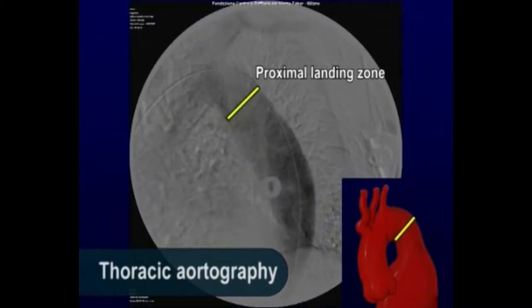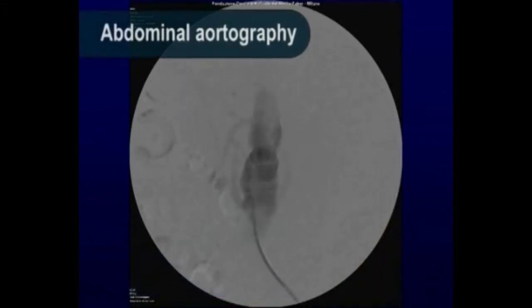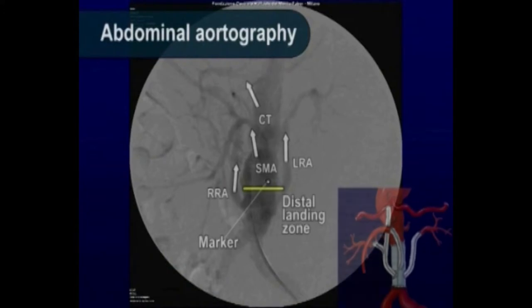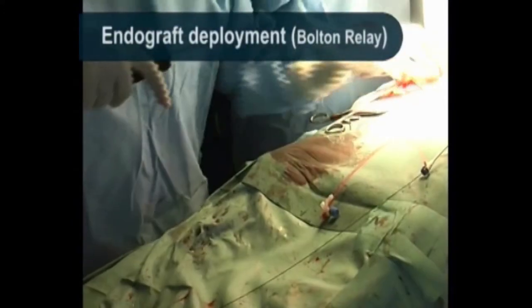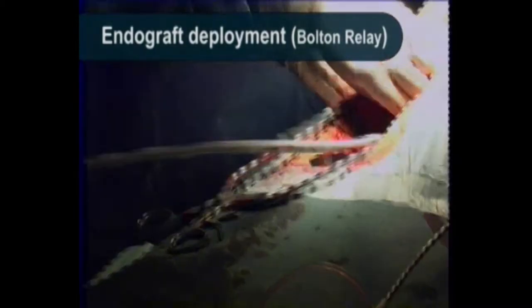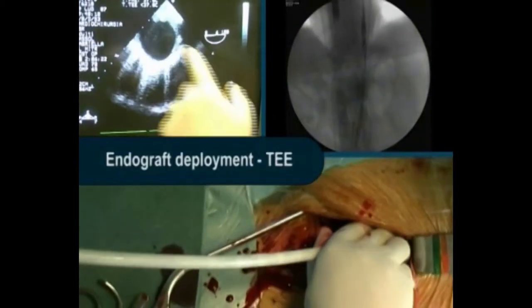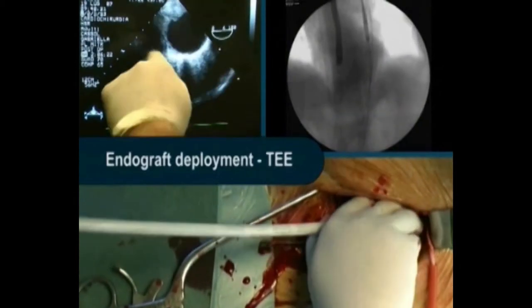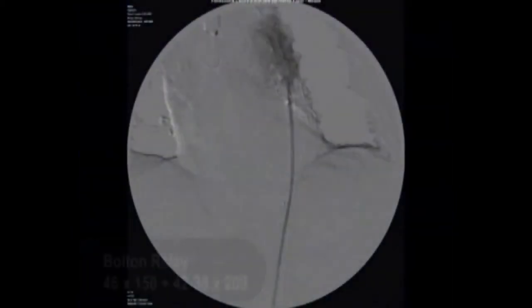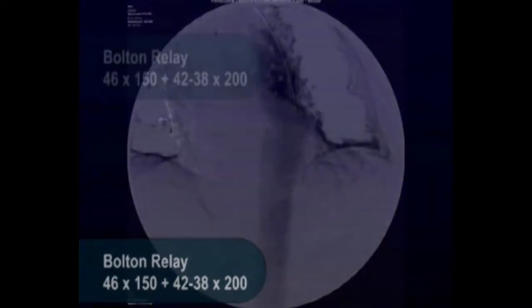An initial arteriography is taken to visualize the proximal and distal necks. Patency of the branches to the visceral vessels is again checked. A regular cylindrical stent graft is inserted through a peripheral access and deployed under fluoroscopy and TEE guidance. Completion angiogram is obtained to show the accuracy and efficacy of the procedure, as confirmed by postoperative CT scan.